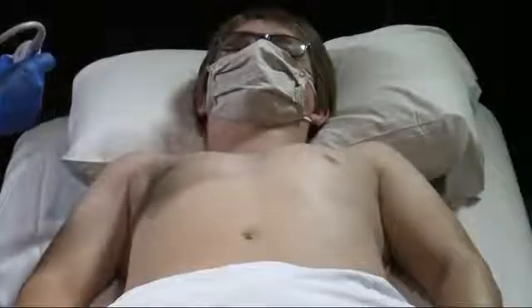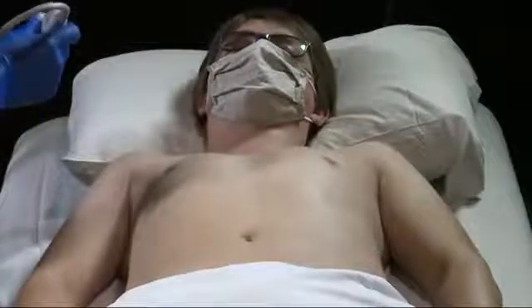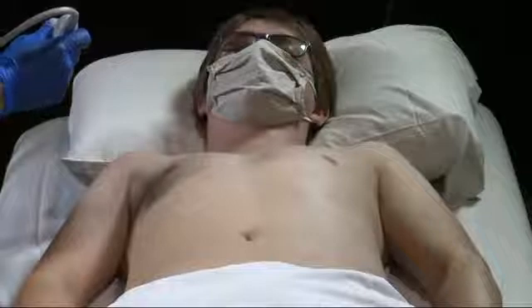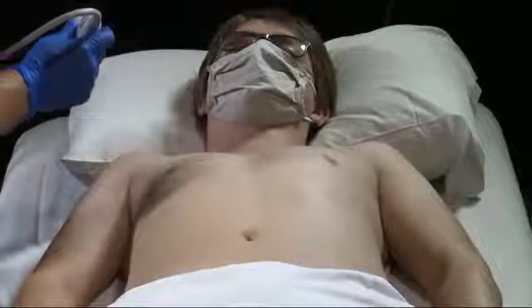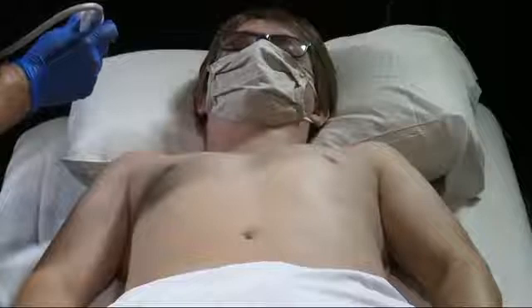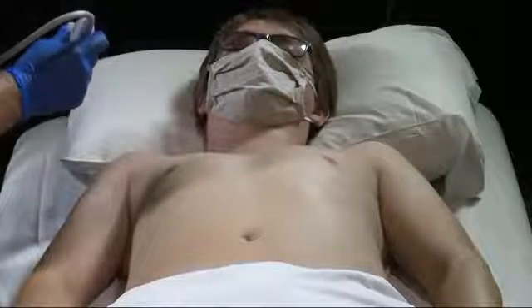When scanning for a pneumothorax, we're going to take a curvilinear transducer. We're going to ensure that we're on the appropriate settings, and we're going to aim for a depth between six and eight centimeters.